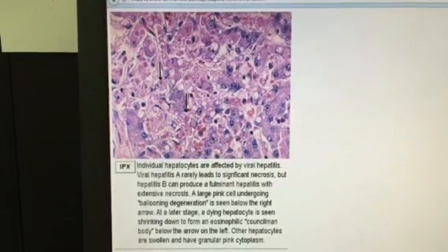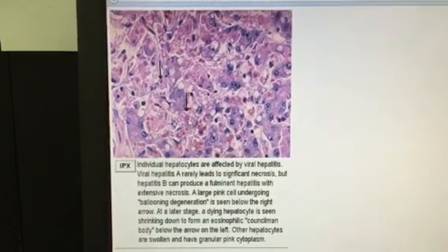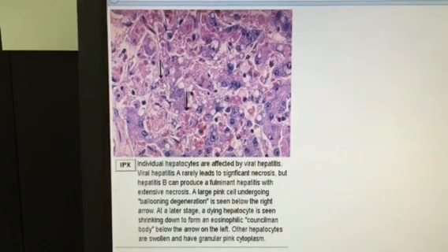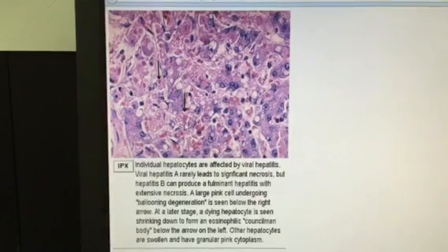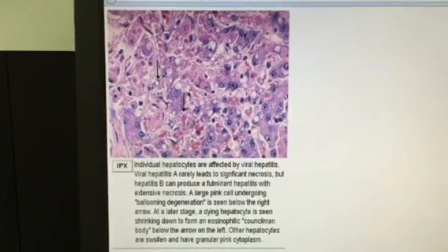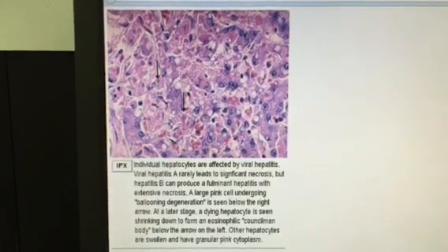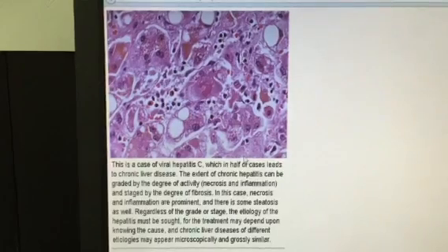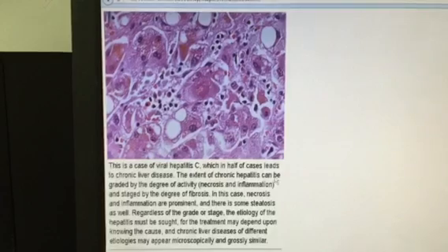First, the necrosis will be ballooning and degenerating of the hepatocyte. Then, after that, the hepatocyte will go into shrinkage and form an eosinophilic accumulation inside the cytoplasm, like this one. So first one will be ballooning and degeneration of the hepatocyte. Then the degeneration of it will be accumulated as a pink granular cytoplasm. This is in case of hepatitis C, leading to chronic liver disease.